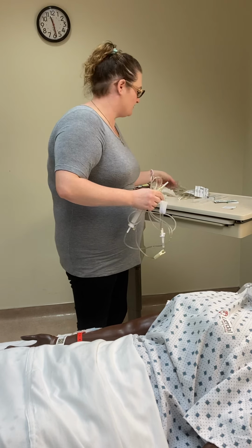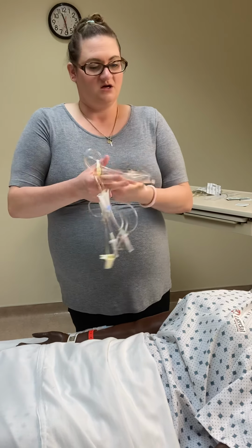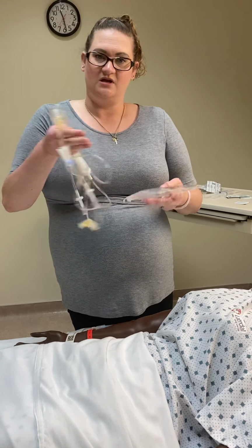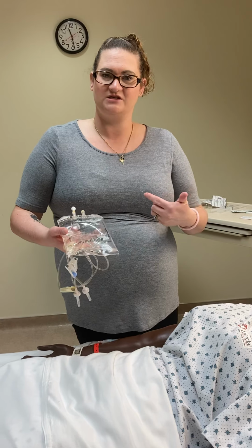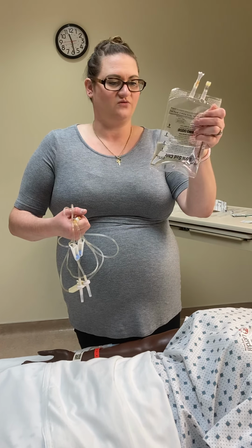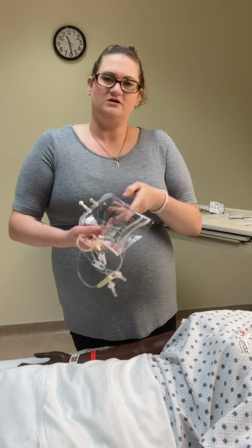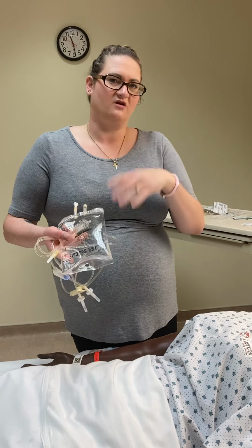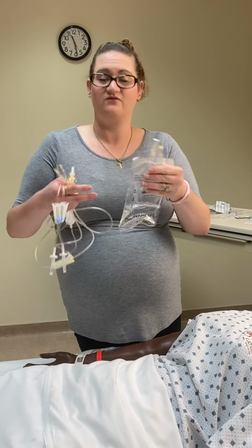All right, and then the other thing I would need is my bag of saline. And just like you would do with any other medication, we check for expiration date, clarity, making sure that there's no rips or tears, that the integrity is good. Oftentimes we'll use like a 250 ml or a 500 ml bag on a regular med-surg floor instead of a full liter bag.